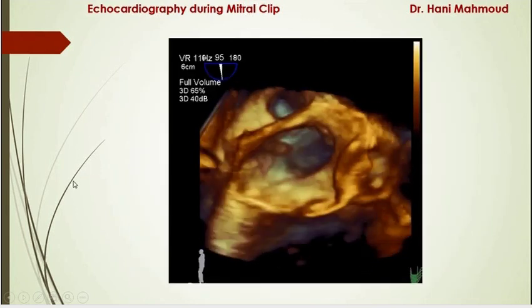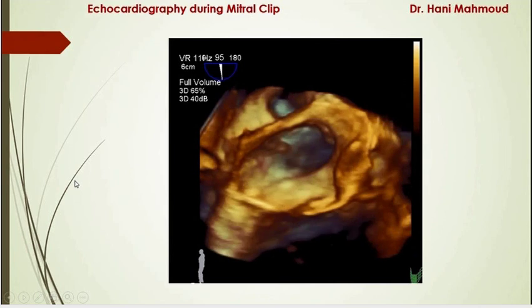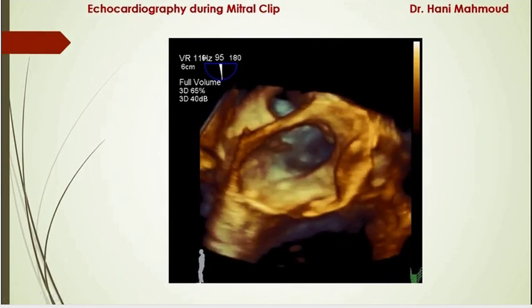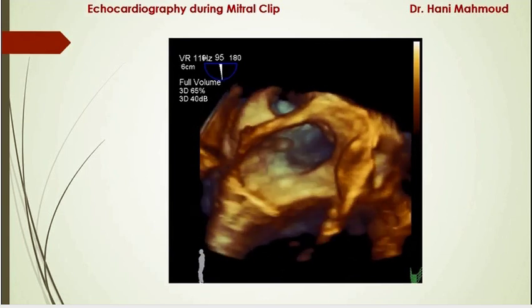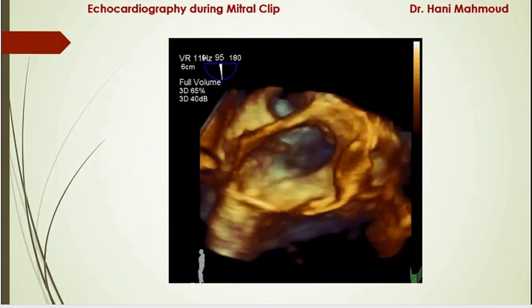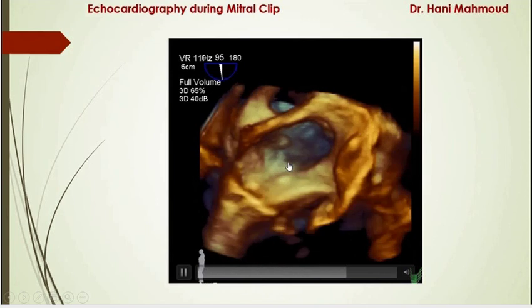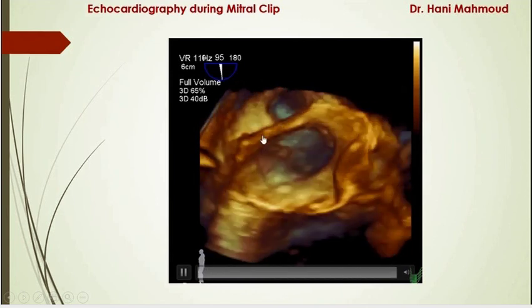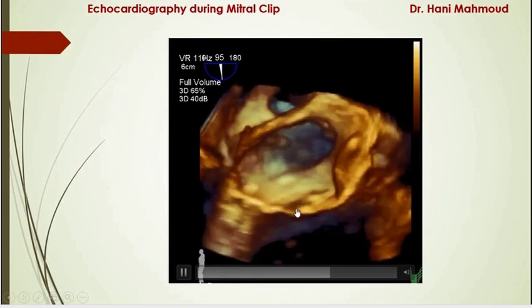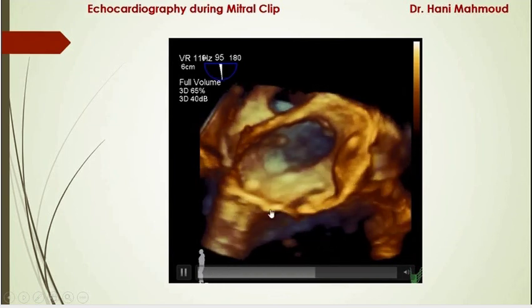We should also look at the left atrial appendage by 2D and 3D — if 3D TEE is available — to exclude the presence of left atrial thrombi, as the wire may accidentally go through the left atrial appendage and cause dislodgement of a pre-existing thrombus. This is the left atrial appendage orifice, this is the Coumadin ridge, this is the left upper pulmonary vein, and this is the lateral commissure of the mitral valve. This is A1, and this is P1.